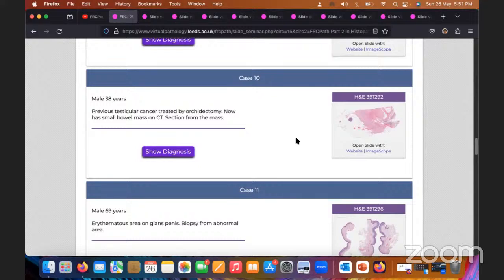One important thing in duct ectasia is that radiologically it can mimic a B3, sorry, U3 or U4 in radiology, because sometimes the inspissated ducts, the secretion, can show microcalcification. And in the section, you need to correlate with that, whether you are seeing a microcalcification or not. That kind of correlation you must do when you are getting the section.